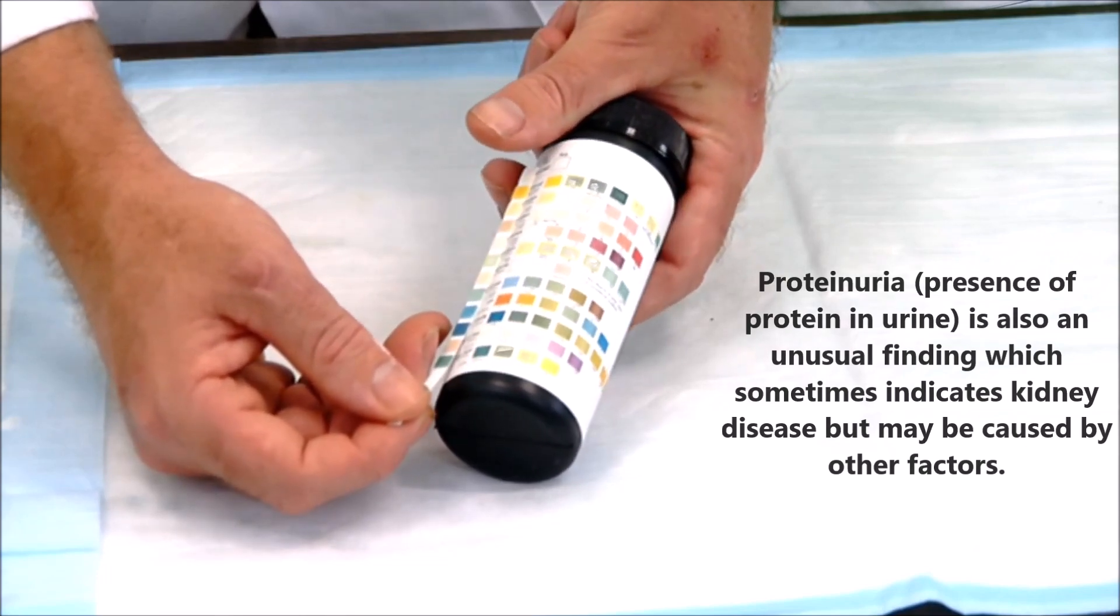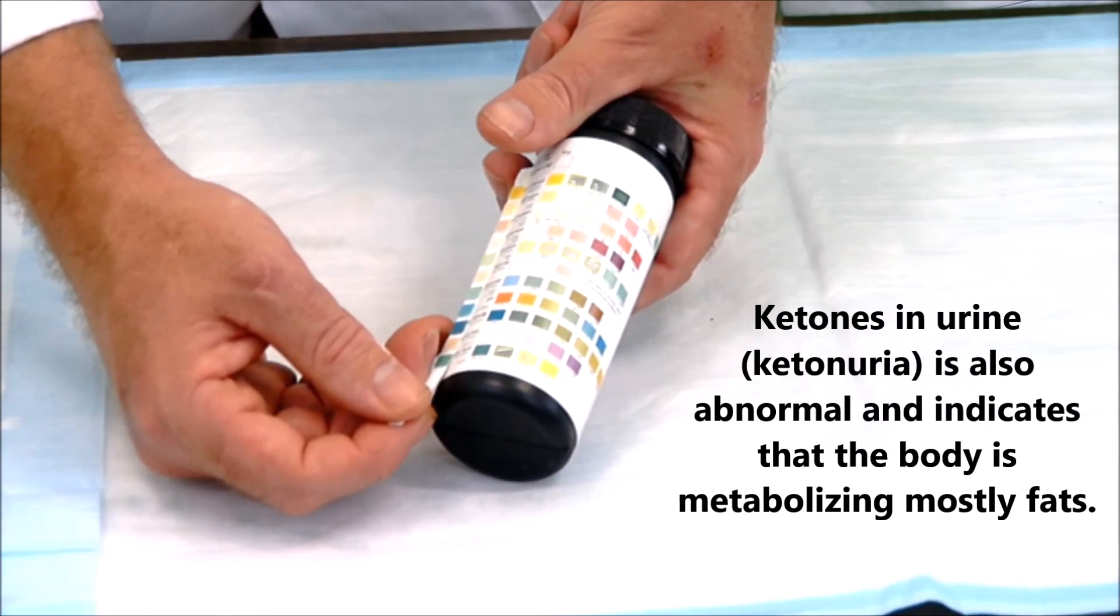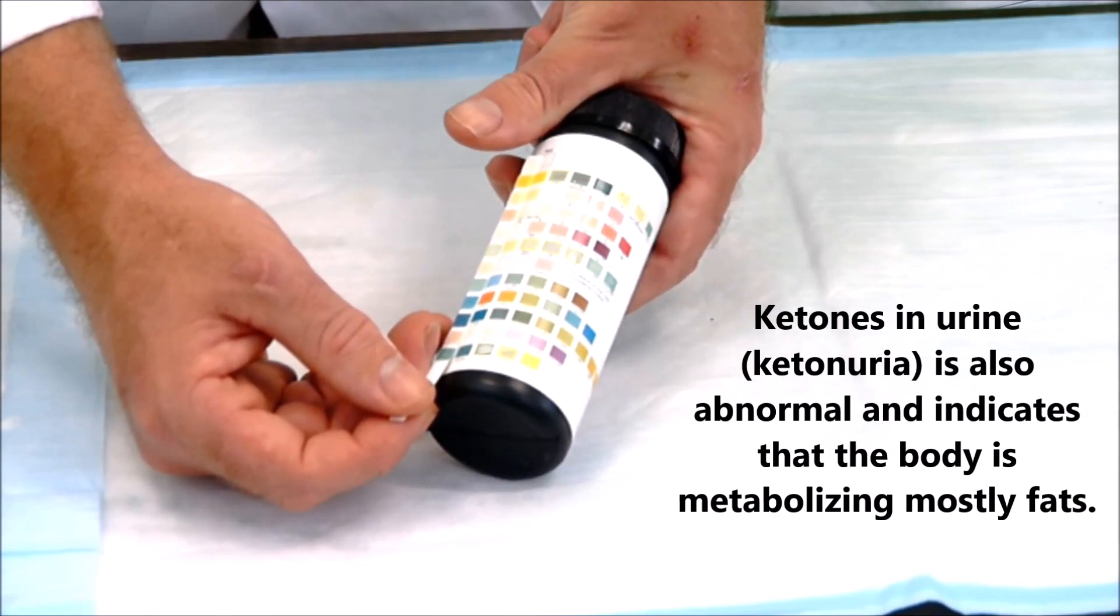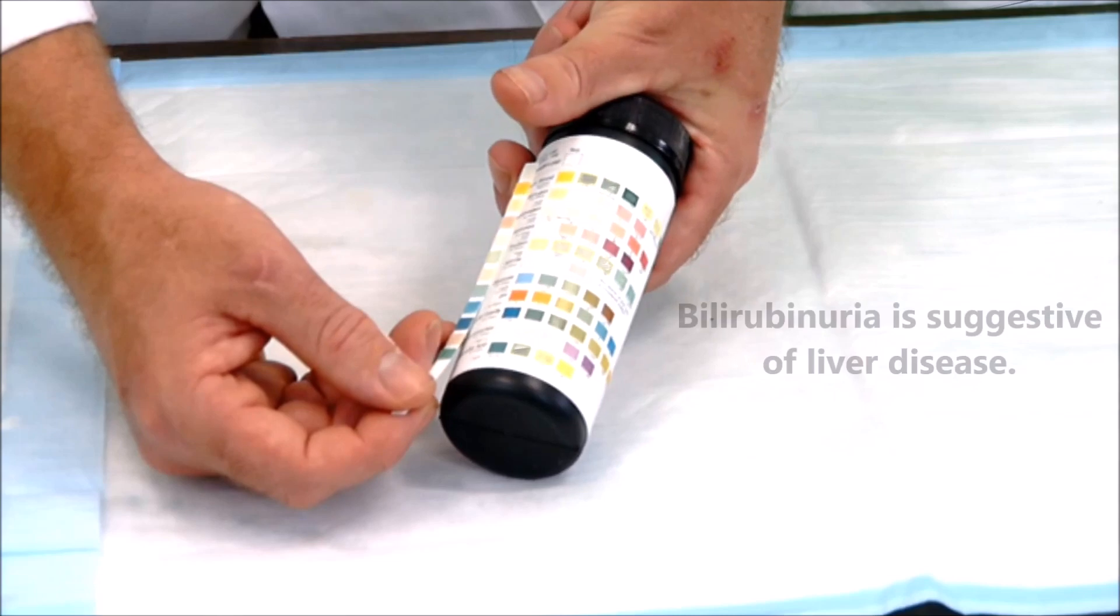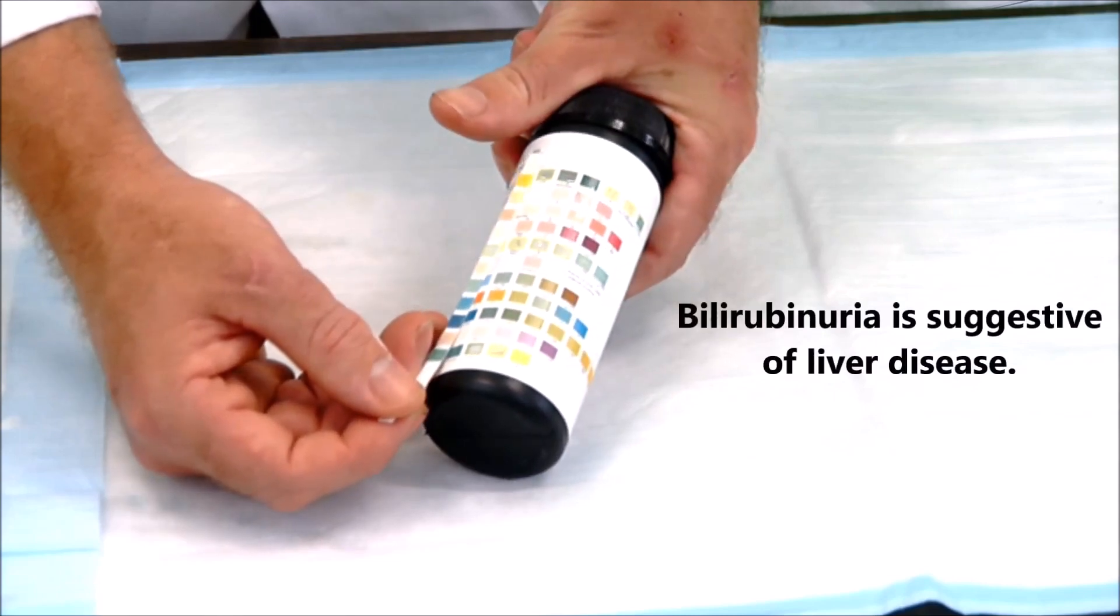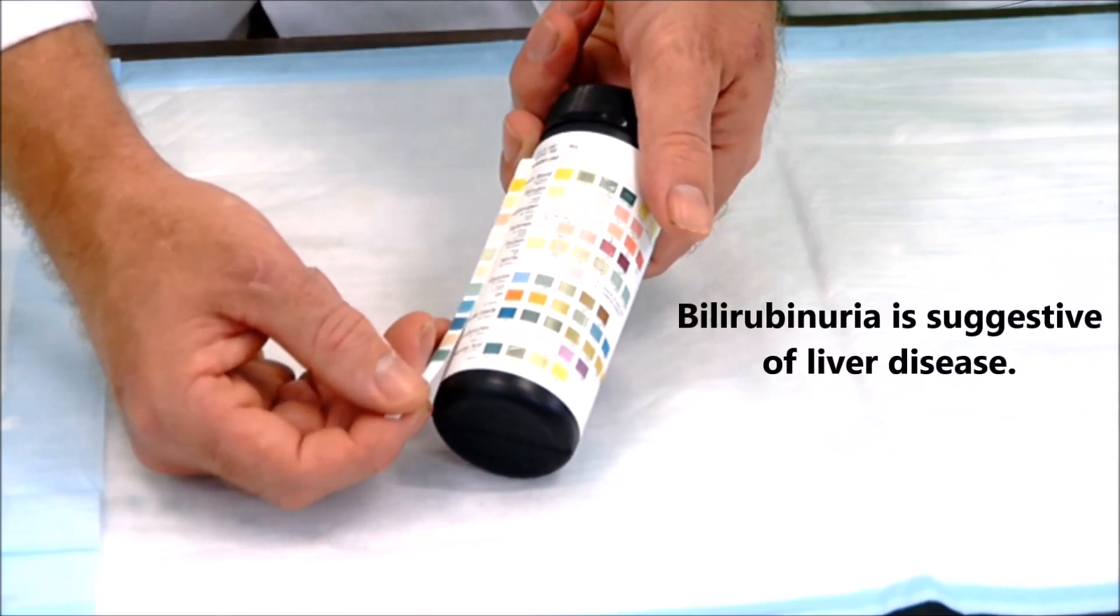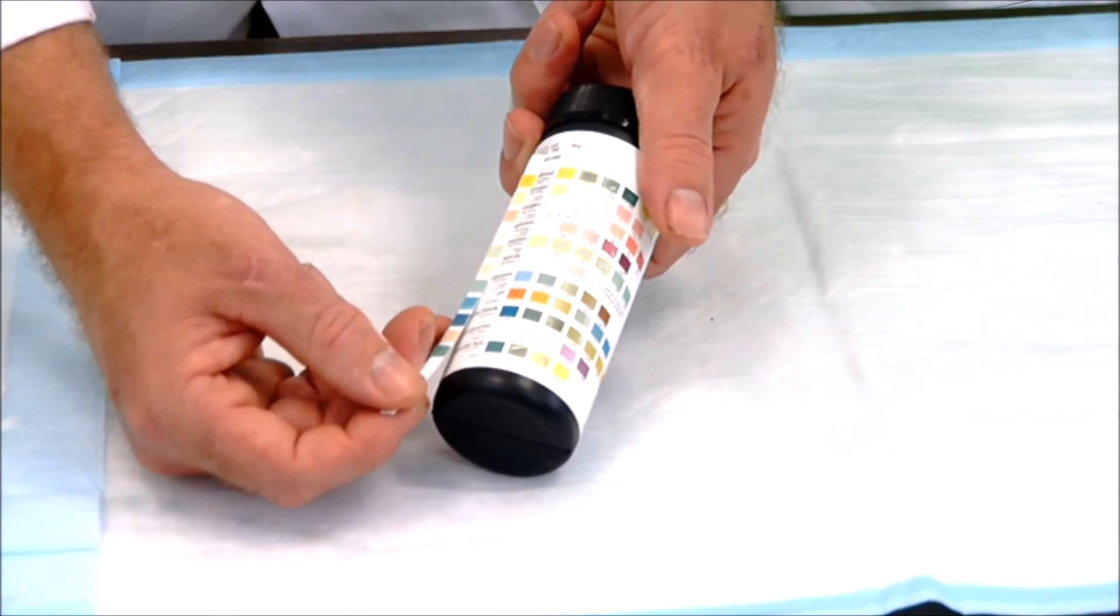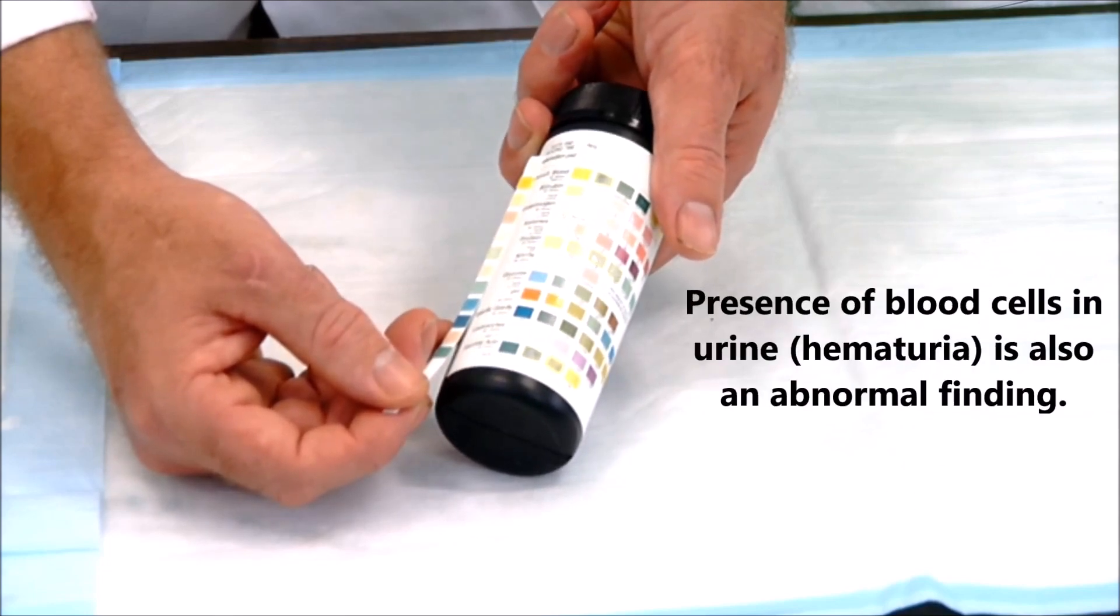And then I'm going to look at ketones. Ketones are produced when we metabolize fats. Here we can see that I have a negative ketone test. Same with bilirubin or urobilogen. Okay, maybe negative to a trace. And then bilirubin up top is negative, and occult blood, which is hidden blood, that's negative as well.